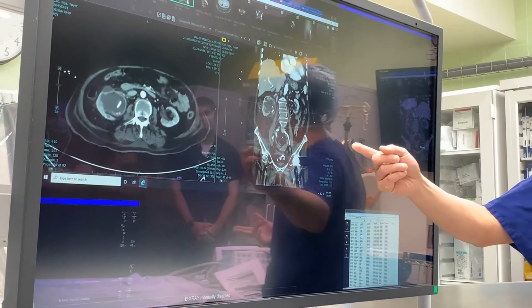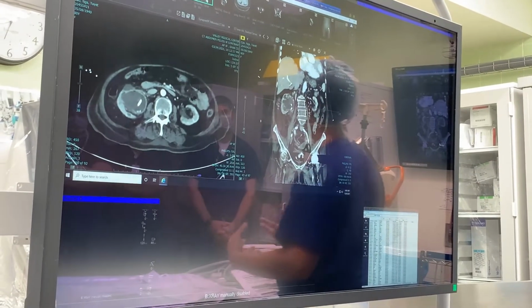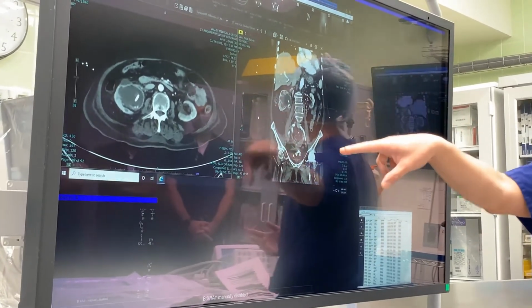Okay? If the obstruction is lower down below the bladder, say if the person has a urethral mass or some sort of pelvic mass, you might be putting in a suprapubic tube rather than two perc nephs, just because it's nicer for the patient, right?